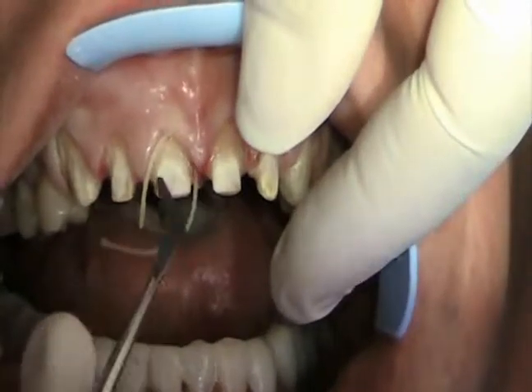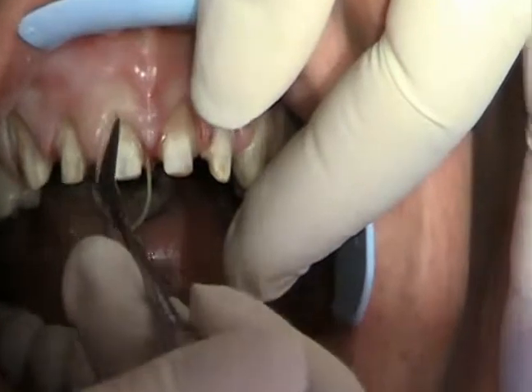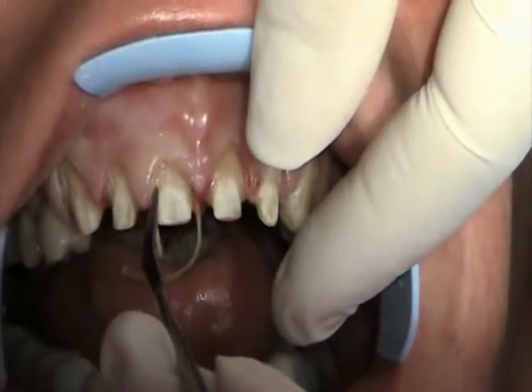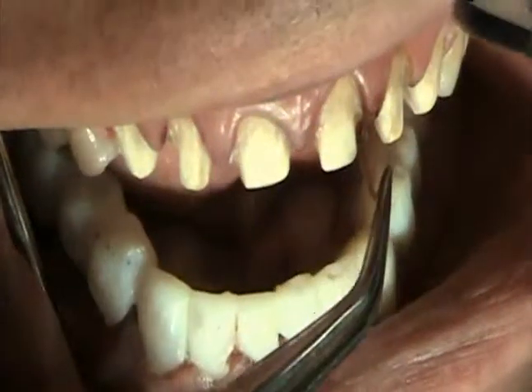Now we're going to pack some cord along the gums, and what that's going to do is get the gums out of the way so we can take an impression. That's what we'll make a mold of, and we'll send that off to the lab — that's what they'll use to construct the crowns.